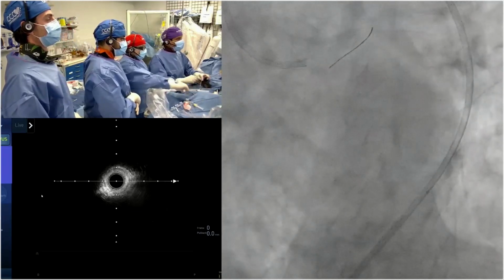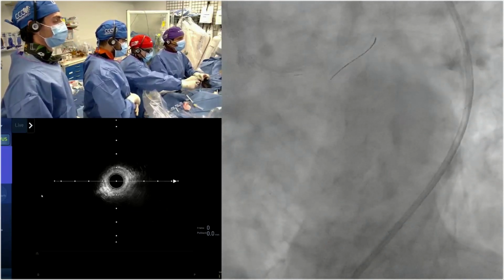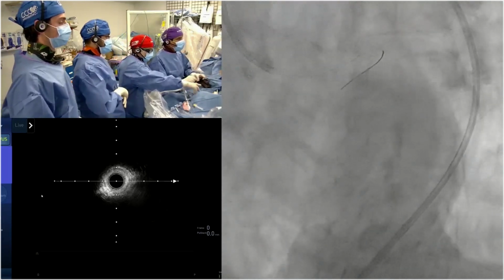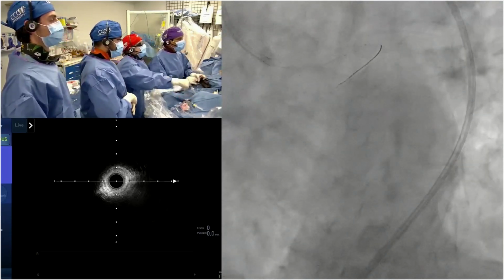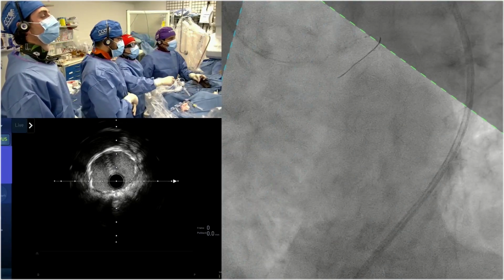With the left main proximal, we dilated with a 4.0 non-compliant balloon at 24 atmospheres. So it became probably 4.25, I would say. And this is where we are. We just want to do the short segment. One second. Yeah, okay, stop. Yeah, just want to concentrate.